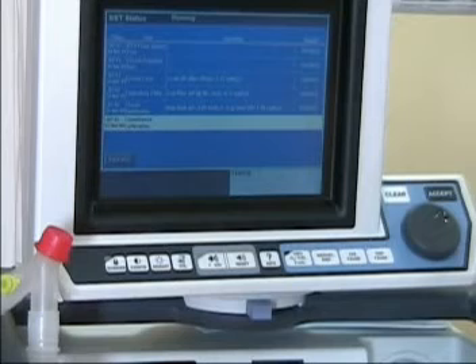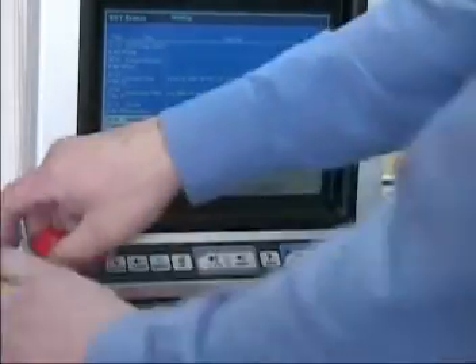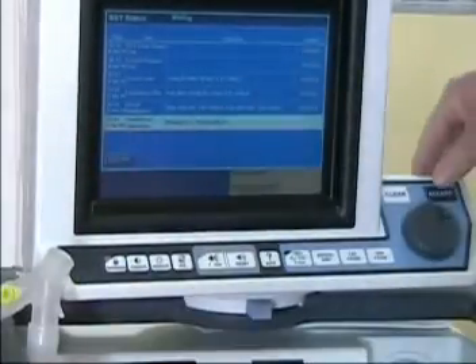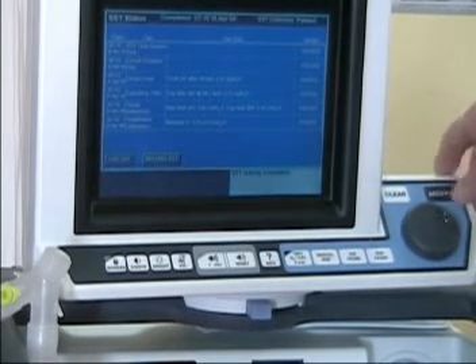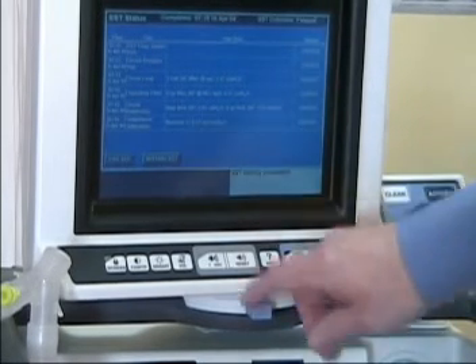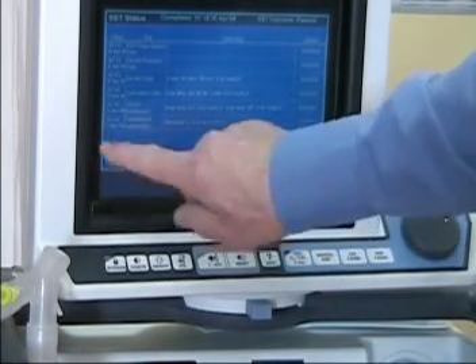It's doing the final compliance test. It says unblock the Y, and I'm going to press accept. SST testing is completed — that finishes the SST.